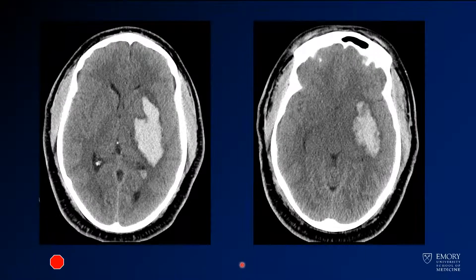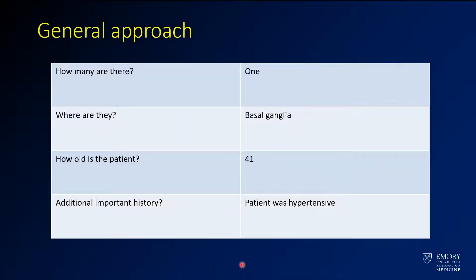When you think about your systematic approach, you want to think about how many hemorrhages there are. This patient has one, and it's centered in the left basal ganglia.